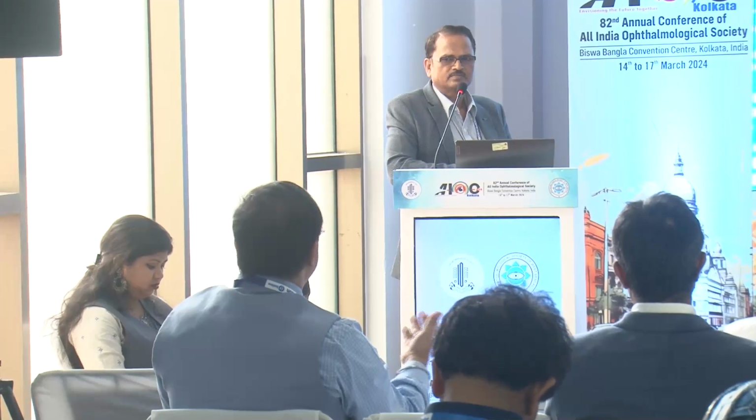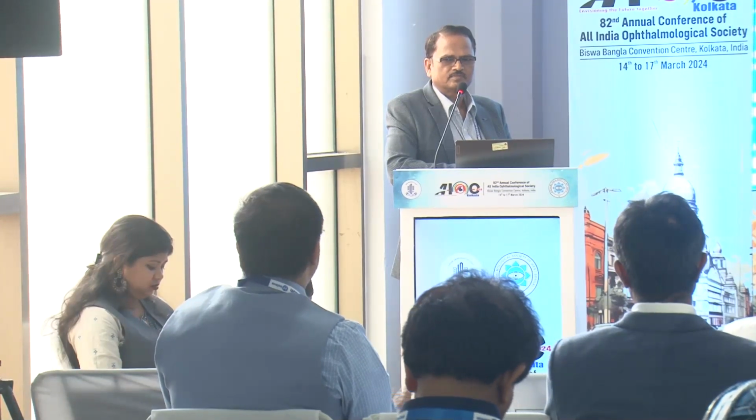In our day-to-day practice, no matter how much we explain in the scientific field that with premium IOLs you should look at the lifestyle, at the end of the day every patient, whether a computer-going, office-going person or a common man, wants to say, "Doctor Sahab, nazdeek mein woh saaf nahi dikh raha hai." And we are coming out with so many lenses, premium monofocals and premium EDOF lenses. But at the end of the day, the patient wants to see near.